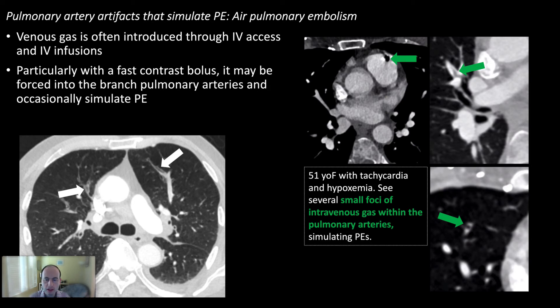Shifting to other things that mimic filling defects: here we have a patient with air entrained into their intravenous tubing before contrast injection. You can see air bubbles in the main pulmonary artery and distal pulmonary arteries. On pulmonary artery windowing you might not notice these air bubbles and could mistake them for pulmonary emboli, but on lung windows you can actually see the air. If you see air in the main pulmonary artery, consider it as a possible artifact.